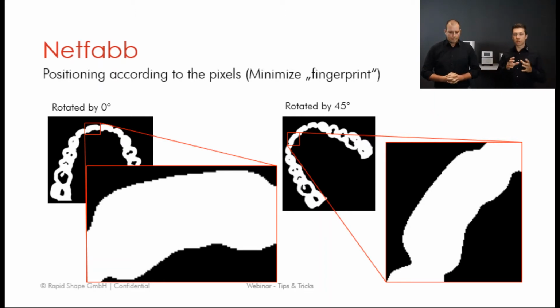It's just affecting always one area. So if you now, like Nisha said, if you're turning it and it's now on the top one, you will see the fingerprint if it's a flat area again. Yes. But the front teeth we were looking at is now smooth. That's right. So it's always depending on the area which you want to remove or reduce the fingerprint. And only this area then you have to place in a certain way.